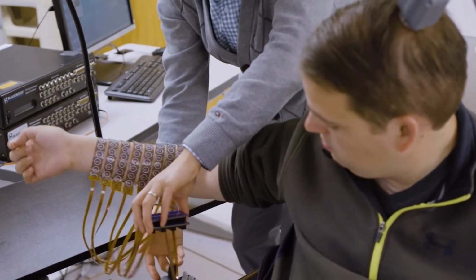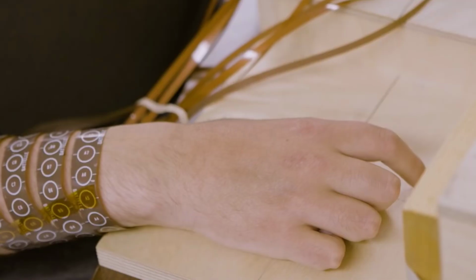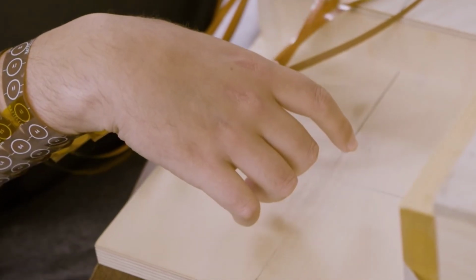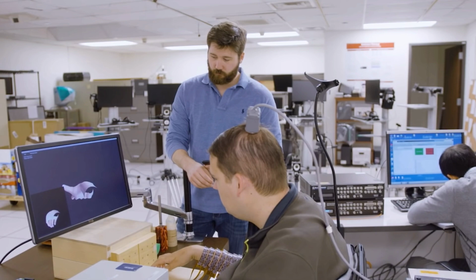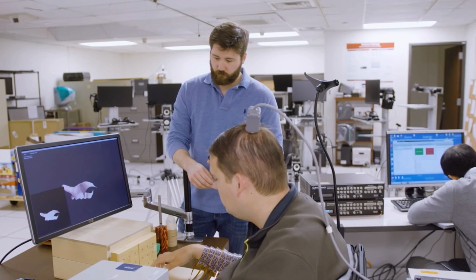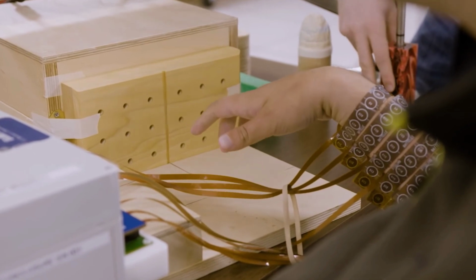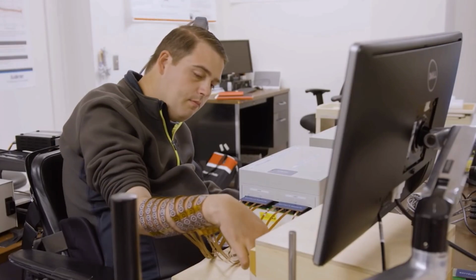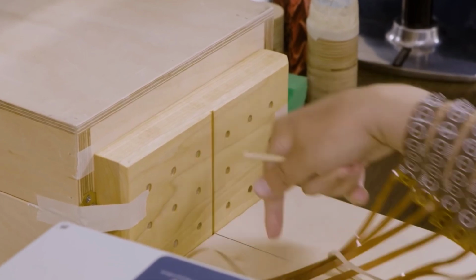The implanted chip picks up the instruction and provides the information to the computer. Once Ian's messages are understood by the computer, it may send a command to a device that is linked to his hand, causing the hand muscles to move. Although this device isn't quite a bionic prosthetic, it does give paralyzed people accessibility to their formerly paralyzed limbs. However, it should be noted that the technology can only perform really basic actions and tasks.